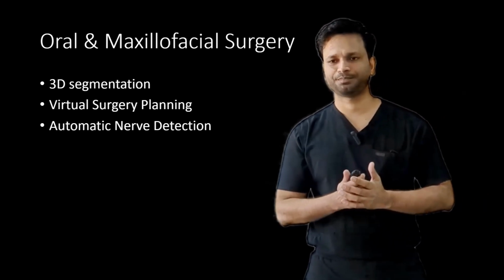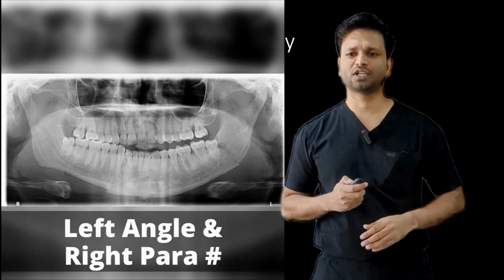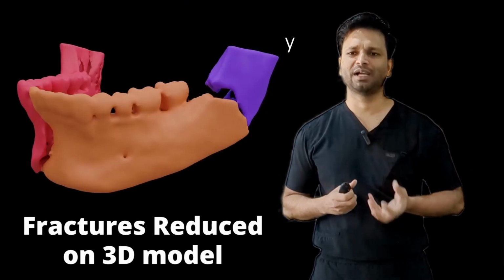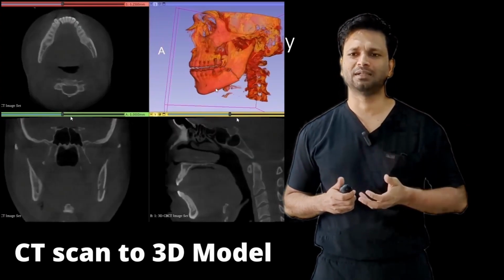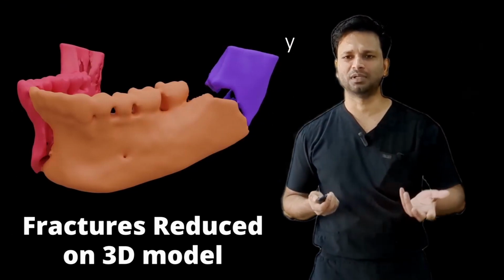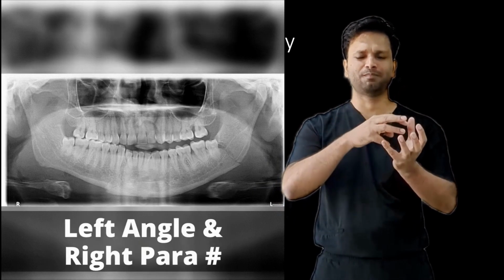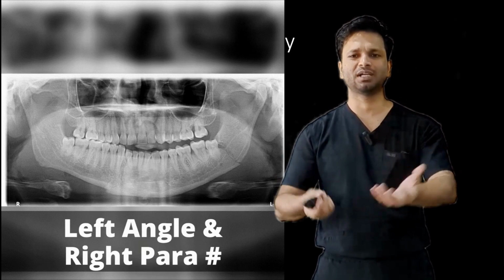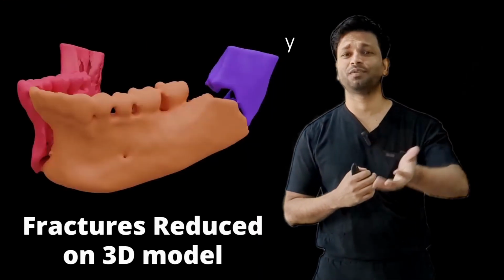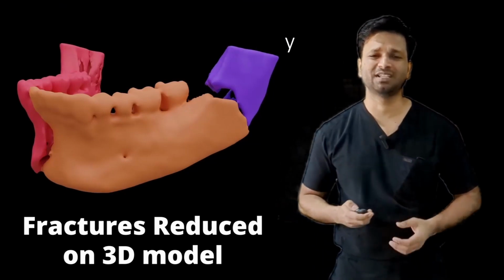Then there's something called 3D segmentation. If you remember this video that I showed you earlier, in this you can see that I created a 3D model of the patient scan, and then using virtual surgery planning, I reduced the mandible and we printed it. Taking the mandible out from the model created from the CT scan takes a lot of time. Even with a lot of experience, I take at least 15 to 20 minutes to segment and take out the mandible from the CT scan.